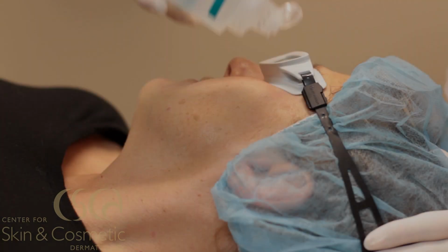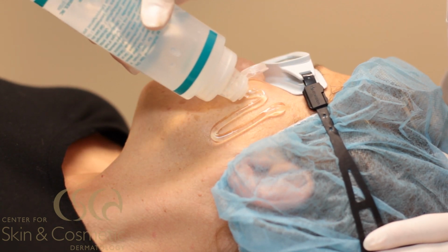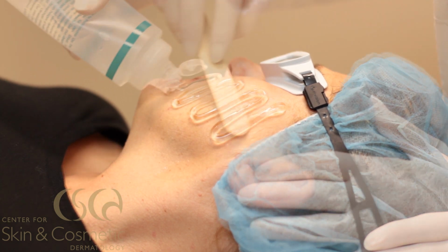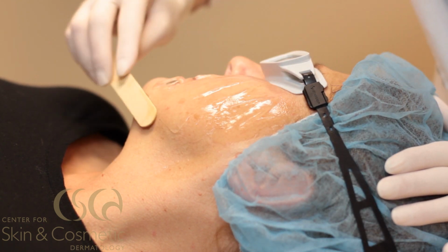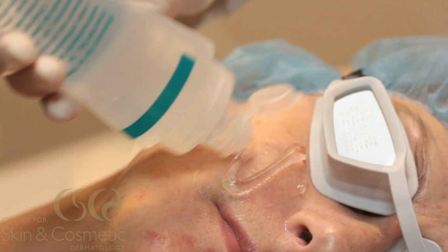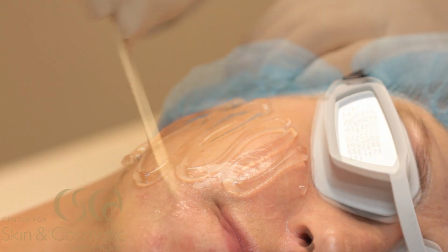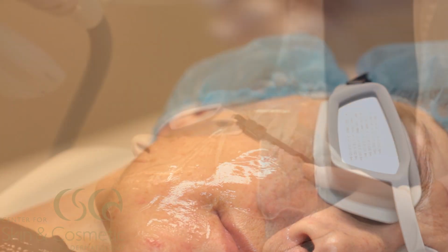And today we are going to be performing a cutting-edge laser procedure, Photofractional, using the M22 laser by Lumenis. After we prep the skin and remove all the makeup and degrease it, get all the extra oils off the tissue, we then apply a clear ultrasonic gel. This gel is used for conduction for the IPL, or intense pulse light device. It helps to keep the skin moist, but it also acts as a cooling agent for the tissue. While we're doing the procedure, the patient is a lot more comfortable using this.